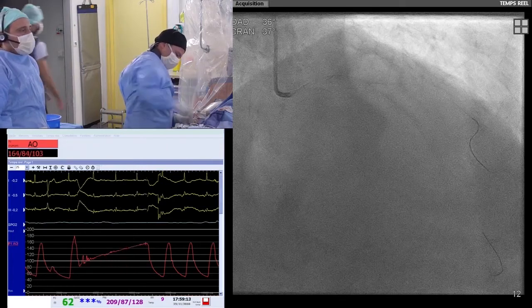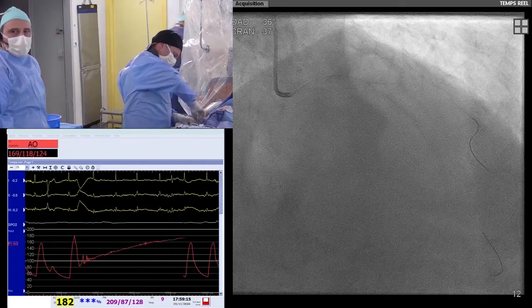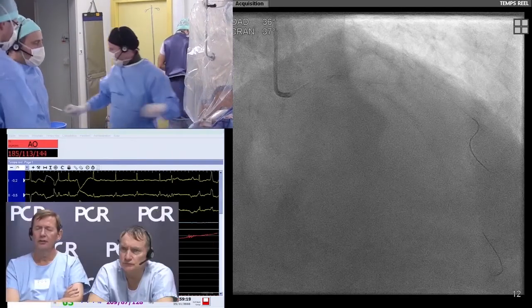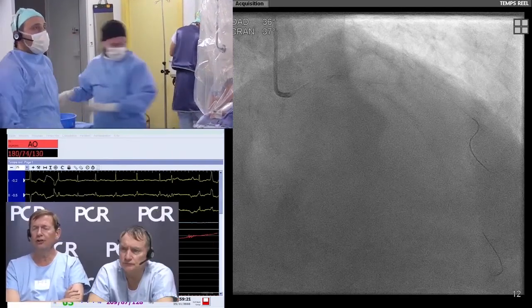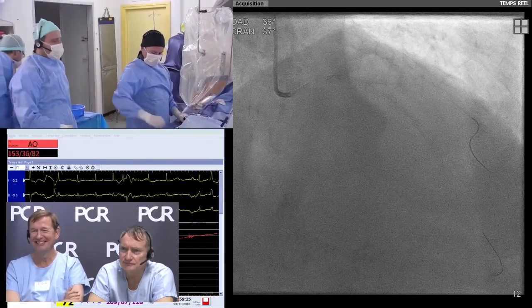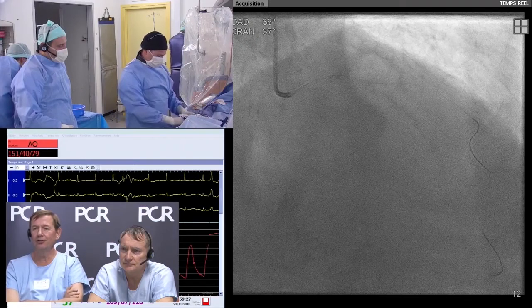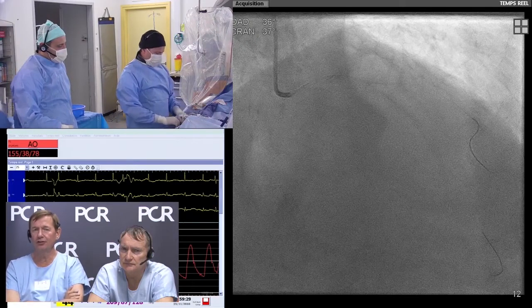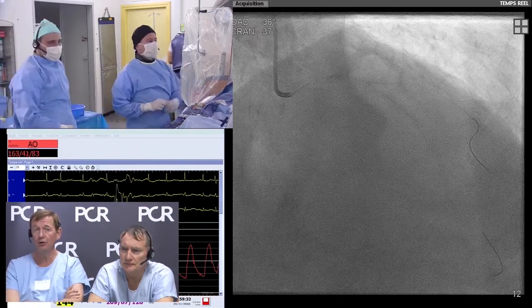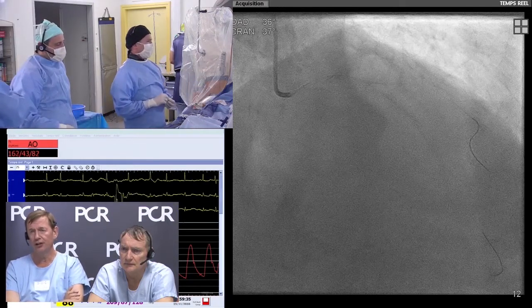Perhaps while we take the balloon, we may answer some questions. We've got a comment saying that somebody who doesn't use rotor will definitely go and buy one following seeing this case, because they observe that a tough calcification, tortuosity, long lesion has been made very straightforward using this technique.